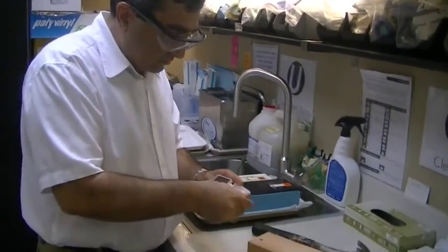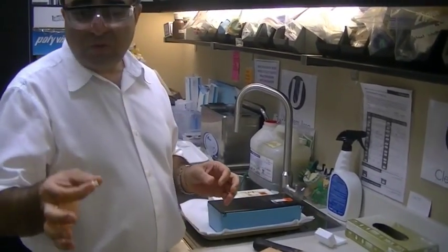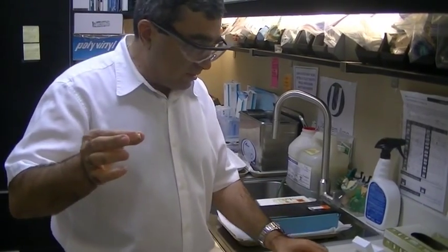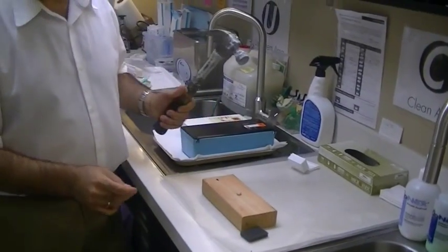Okay, I'm going to take the crown. This is a new unbreakable crown made from pure zirconia. I'm going to put it on this piece of wood, and I'm going to hammer it in.